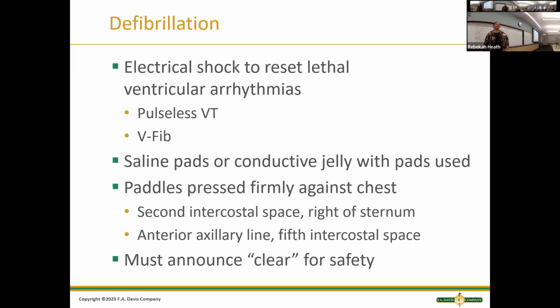You say clear. And then what I was trained is that if I'm the one going to shock, I'm going to say, okay, everybody clear. Everybody around the patient goes clear, and they step back to ensure that yes, they are clear. Because if you're dealing with the patient and you're still touching something and you shock, what happens? You get a second patient because now I'm on the ground, you know? So you want to make sure if you ever have to be part of that, everybody is safe.